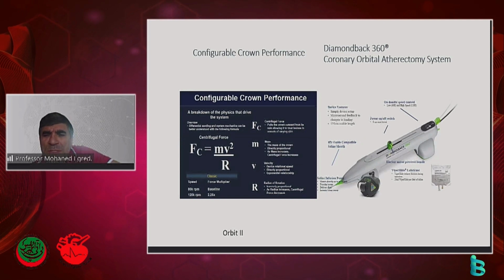And again, very similar to the rotablation in a way, even when you handle it in terms of how you perform the procedure. But the difference in this is you have to go very slow and really take your time. And also you could do it antegrade as well as retrograde. So if you pass the lesion, you could always ablate the calcium going back.